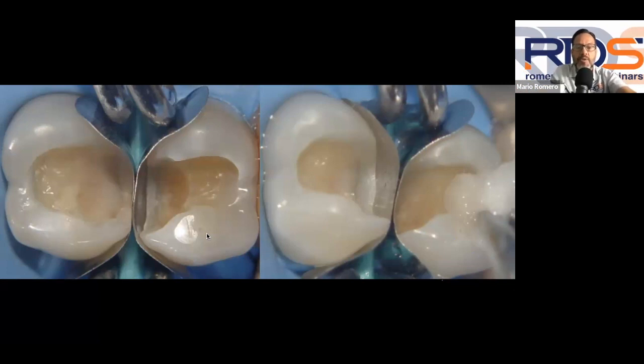So again, this is the reason why I still recommend using this ring, because as you can see, I was able to accomplish ideal anatomy of both of the bands. And not only that, I was also able to use a large enough wedge to create orthodontic separation of these two teeth to compensate for the thickness of these two bands. This is critical for you to understand. You're going to get some separation of these teeth because of the pressure created by the Bitine rings, but you also need to create some additional separation by means of a wedge so that you can compensate for now not one band, but the thickness of two bands.